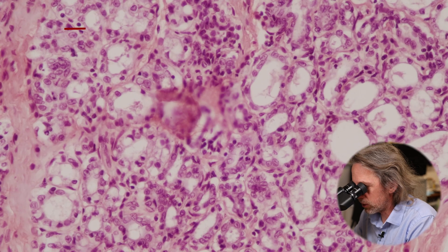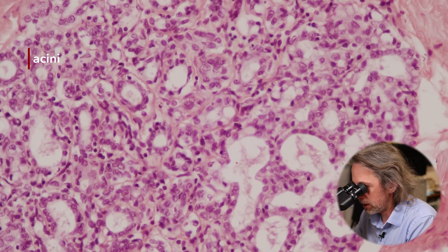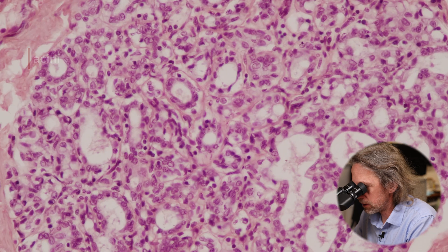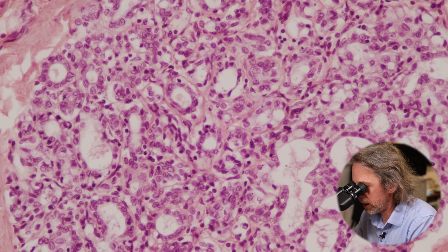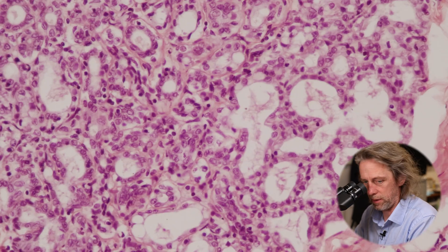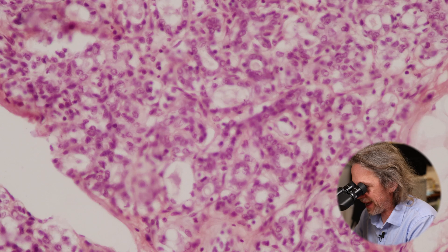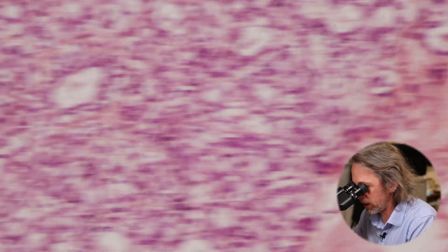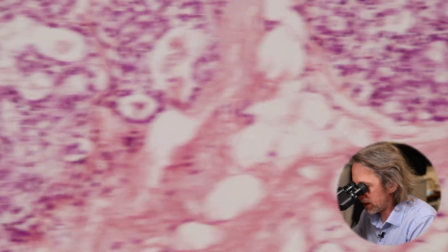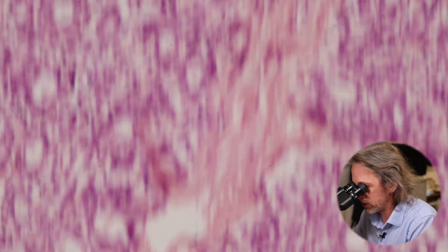These secretory units are called alveoli or acini. We can see some acini there and also get a sense of the branching of the ducts. Remember, this is a lactating breast — an active breast producing milk. So as we slide around, we see dense connective tissue, some fat, but a lot of glandular tissue.